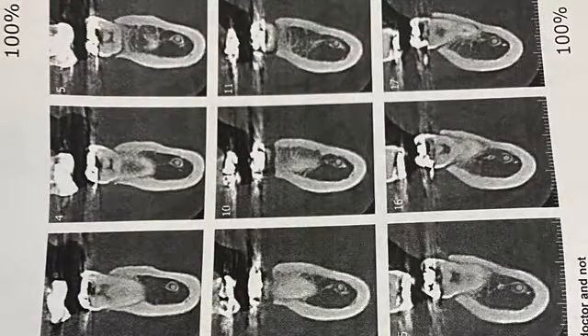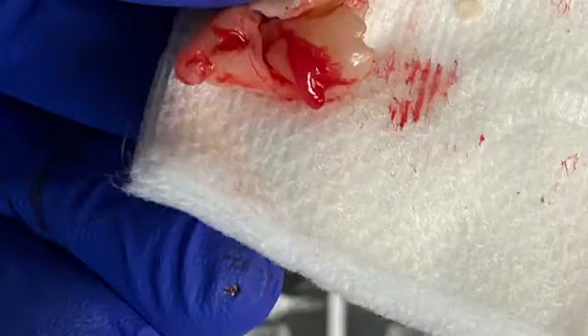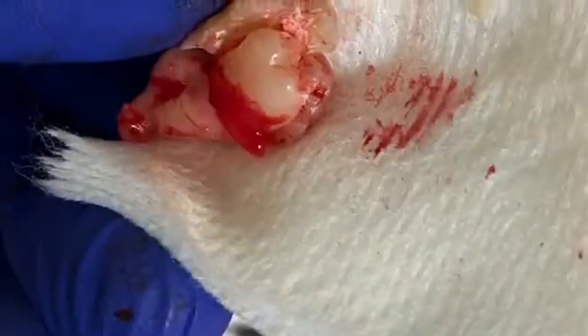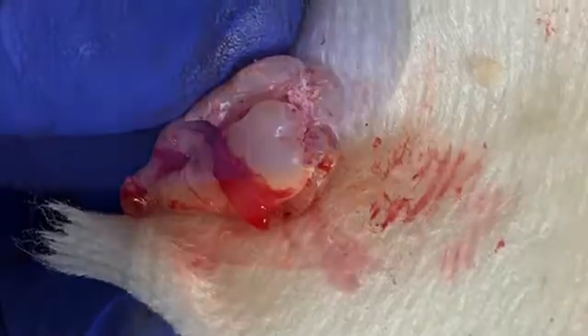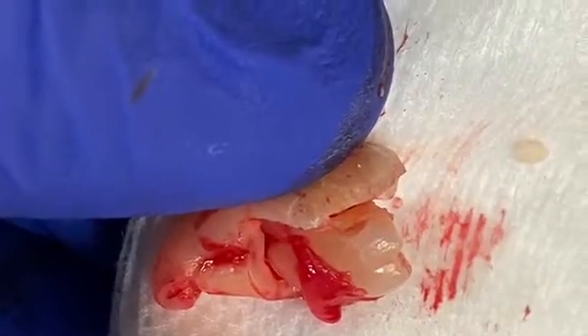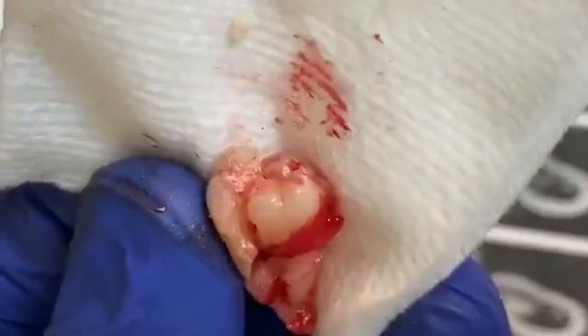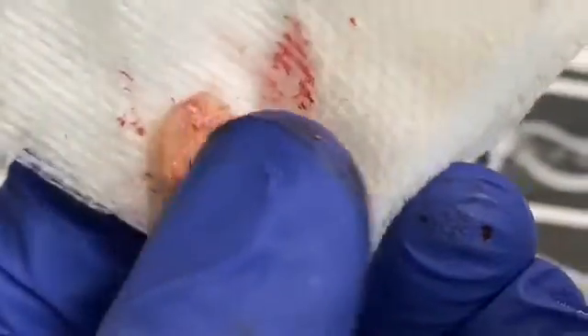These are the CT scan views, and you can see the different angles. Take a look — the tooth came out in three pieces. I actually had to use a surgical handpiece to dissect the tooth into two, but when I split it, it broke further. That's the reason why we had to pick it out in three pieces.